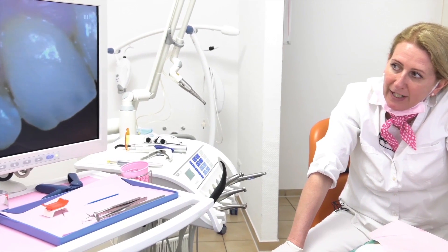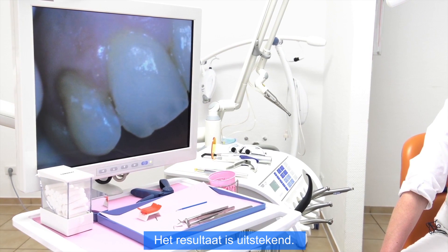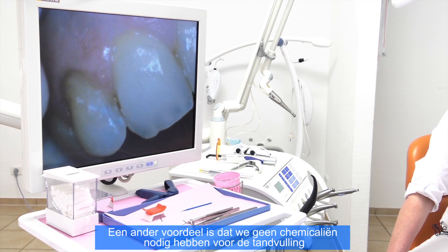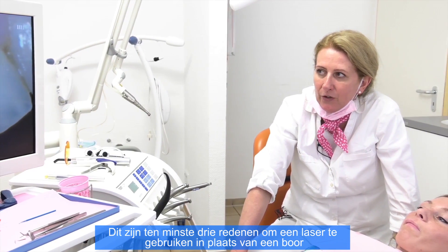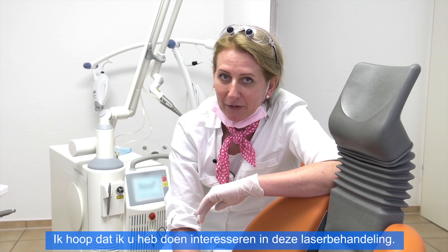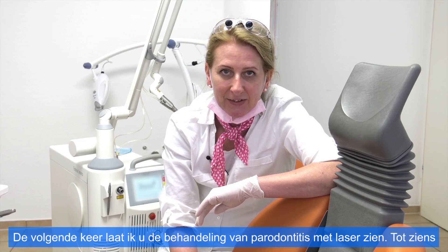Remember that we needed only two to two and a half minutes, and the result is perfect. We don't need any chemicals to make our filling — those are at least three reasons to choose laser preparations. I hope I could inspire you for laser preparation. Next time I will show you the treatment for gingivitis. See you.